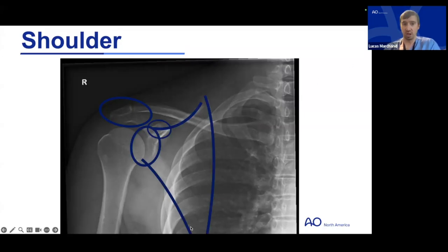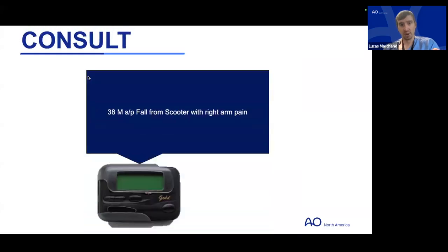And we also are seeing some ribs and a lung field, which I'm not great at interpreting, whether or not there's a presence of a pneumo. But it is something when I do have images like this that I'm at least making note of when I'm going through the radiograph. So don't in isolation look at the segment you're interested in or just the skeletal injury, because that is a recipe for missing something important.